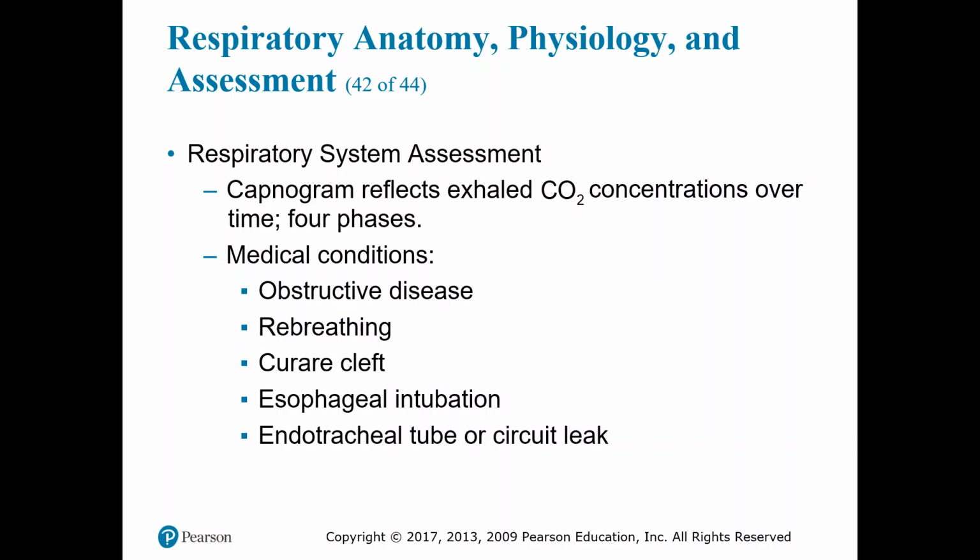Curare cleft appears when neuromuscular blockers begin to subside. So in an RSI or an artificially paralyzed patient, when those meds start to wear off, you may see a cleft or a dip at the plateau, towards the end of the plateau. The depth of the cleft is inversely proportional to the degree of the drug activity. So the deeper the cleft, the less the blocker is working. That makes more sense.